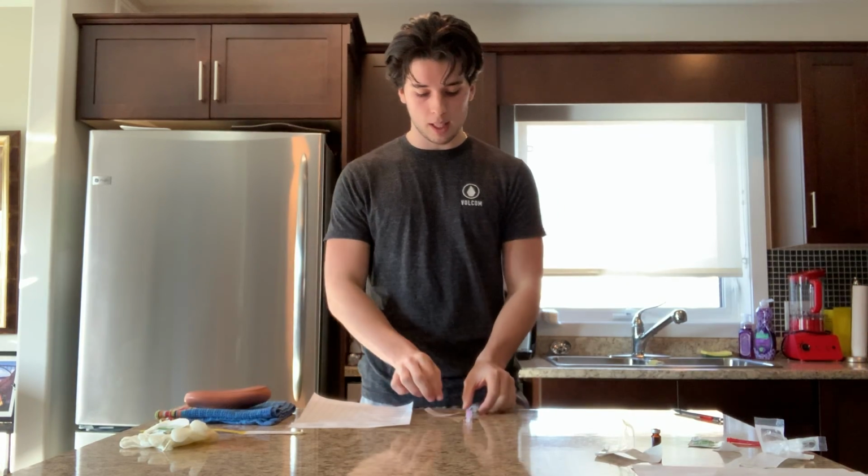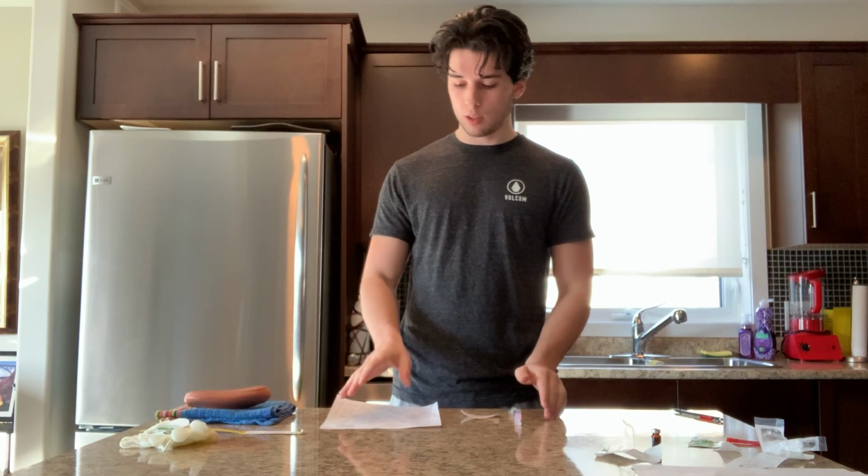So then right away, I'm going to tell them that I'm just going to do my third check. And so I'm going to grab my label, my syringe, and my MAR, and I'm going to do a quick third check.